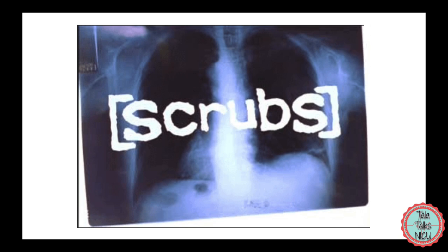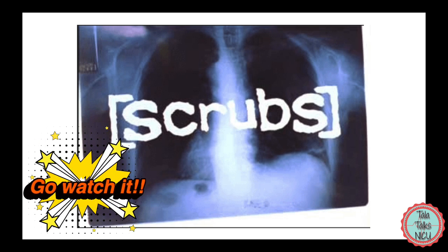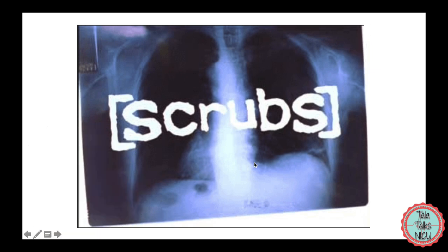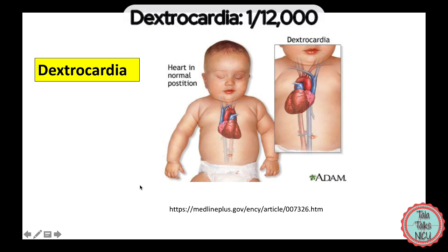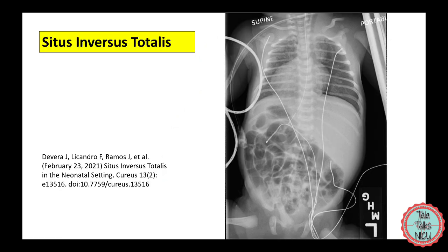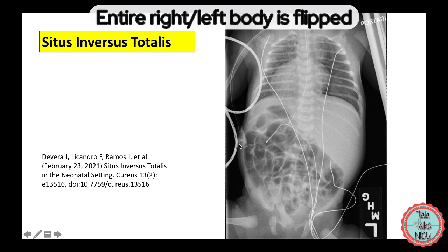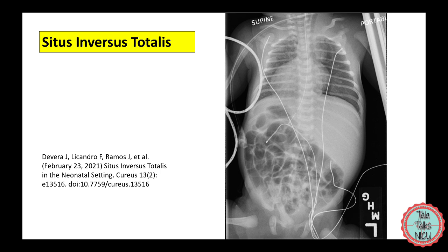Now let's start with this x-ray, which was shown at the start of each Scrubs episode — arguably the funniest and most realistic medical show ever. The heart is pointing to the right instead of the left. This is what we call dextrocardia, a general term meaning the heart is on the right side of the chest. It happens in about one in 12,000 births. Sometimes we miss these on x-ray because we assume the x-ray was taken prone instead of supine, which is why it's so important that x-rays are labeled.